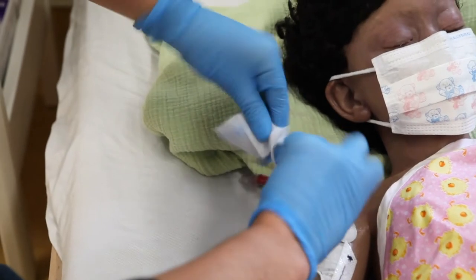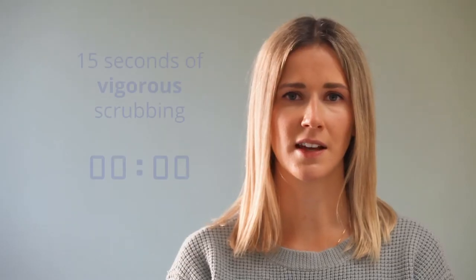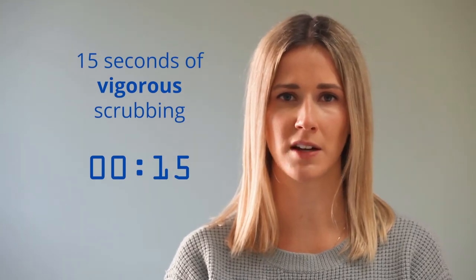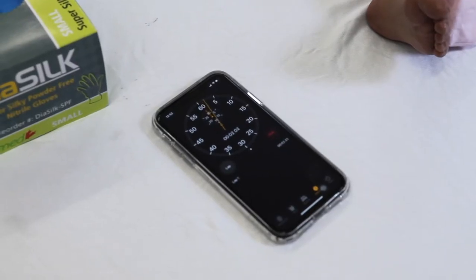Carefully open the alcohol swabs and unfold them to increase their surface area. Carefully pick up the cap and line, maintaining non-touch technique. Scrub vigorously using friction for at least 15 seconds, moving down the line and paying special attention to the connection. It takes at least 15 seconds of vigorous scrubbing to effectively remove bacteria that may have built up on the surface of the CVAD or cap.